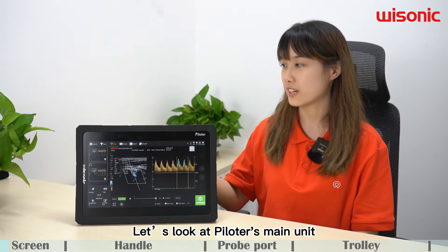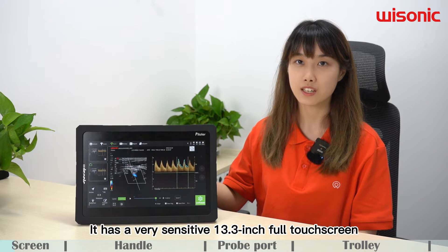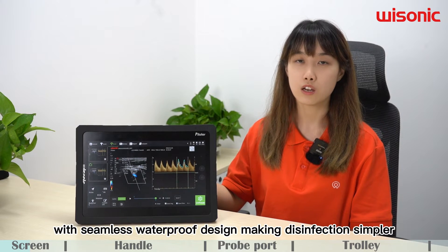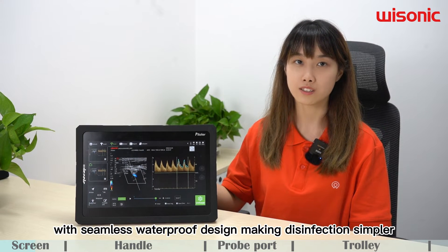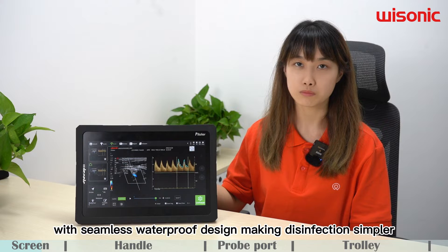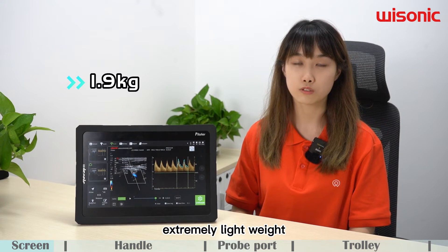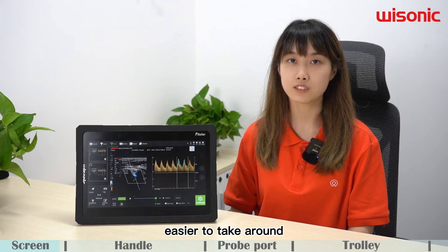Let's look at Piloter's main unit. It has a very sensitive 13.3 inch full touch screen with seamless waterproof design, making disinfection simpler. It weighs only 1.9 kg, extremely lightweight, making it easier to take around.